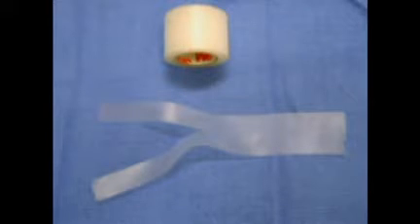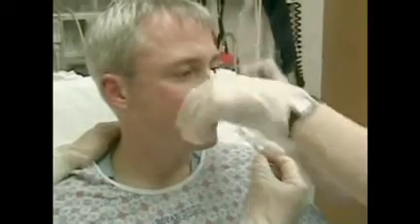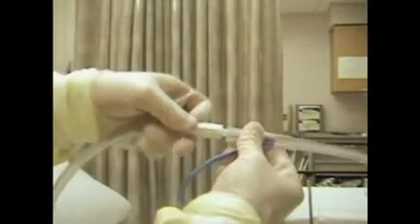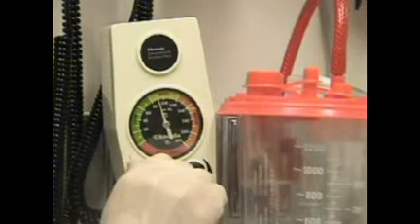Take a 5 to 7 centimeter strip of adhesive tape and tear it vertically for one half of its length. The wide section is placed across the patient's nose and the two tails are then wrapped in opposite directions around the NG tube. You may now connect the nasogastric tube to suction. Turn on the suction and adjust the vacuum force as desired.